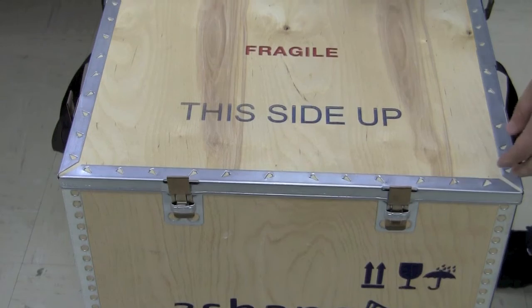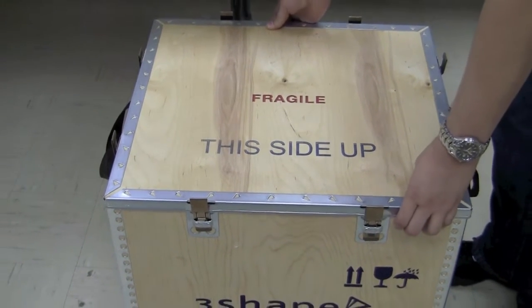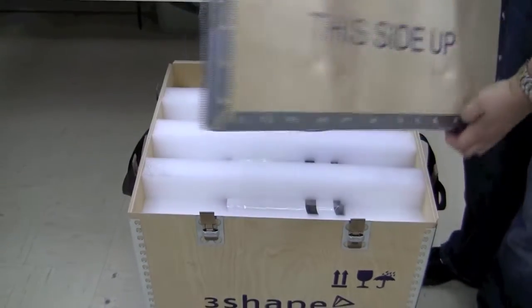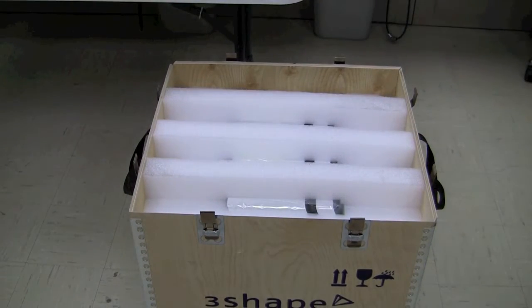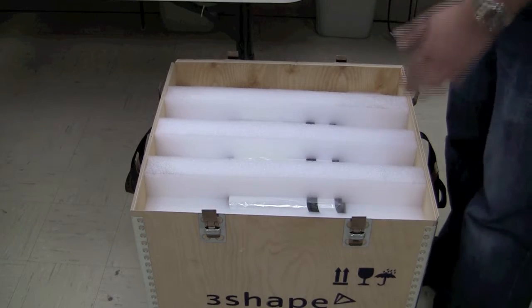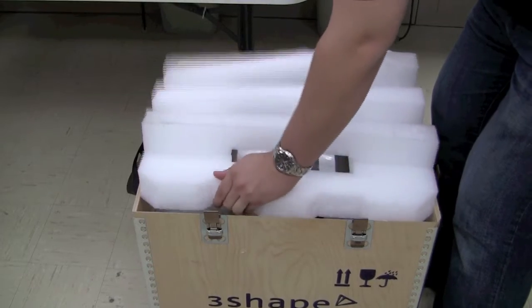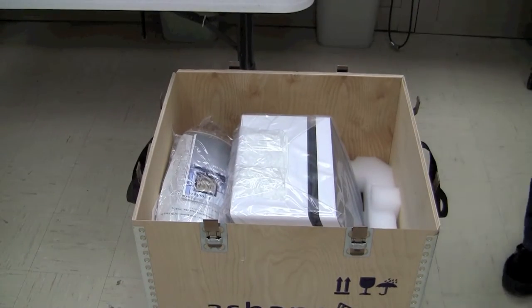Once all eight clips have been loosened, simply pull the top of this crate directly off and set it aside. The next step is to remove the protective foam that holds this scanner in place during shipping. Just pull that straight up and set it aside as well.